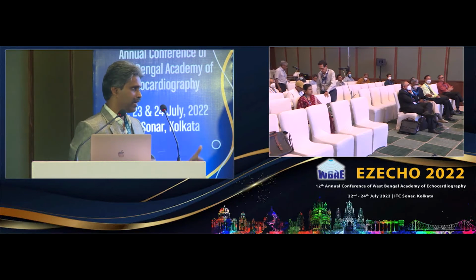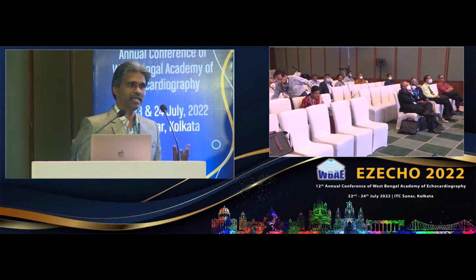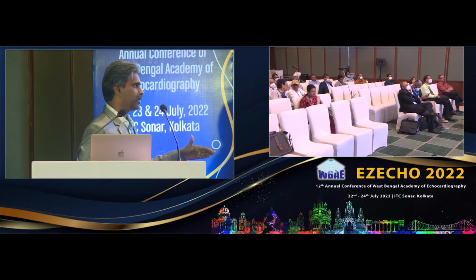Dr. Kumar? Coming to the calcium scoring, I think as a team of cardiologists here, we now have to take a decision. In our center, we have calcium scoring as a separate order, where people will be doing only the calcium score as part of the risk assessment. If the calcium scoring is very low and no other risk factors, then we may not do the CT. What is the average cost of just an EBCT? Only CT calcium scoring costs 4,700 in our center.